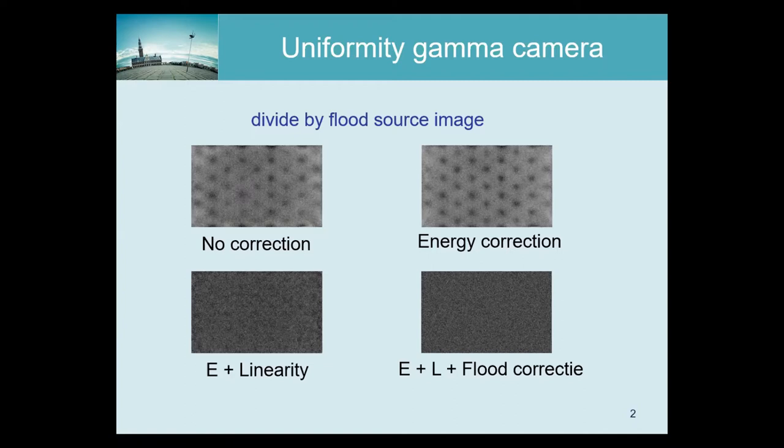We have this cobalt-57 source. They emit photons of 122 keV, so close to technetium. And you can put them on the collimator or between two camera heads, and then you can acquire a uniform image of that plane source. The manufacturer guarantees that it's uniform within, I think, 1% or something.